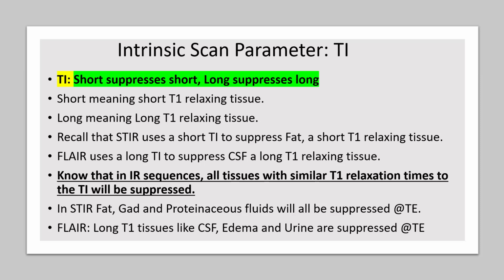No, not really. Can you run STIR after GAD? Yes, you can. Will you see the effects of the gadolinium on STIR? No, you won't. Will the patient burst into flames because you ran STIR after GAD? No. But just don't expect to see signal from gadolinium on STIR because GAD is suppressed. It's got a short T1 relaxing time.